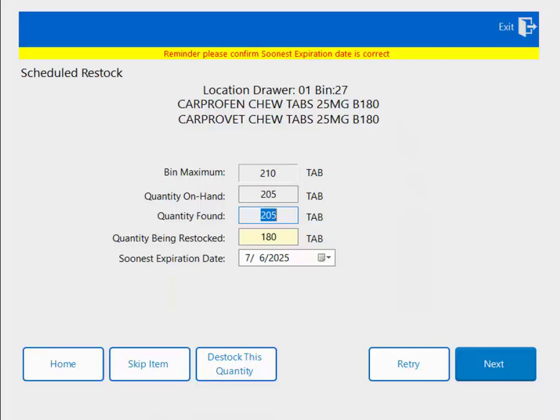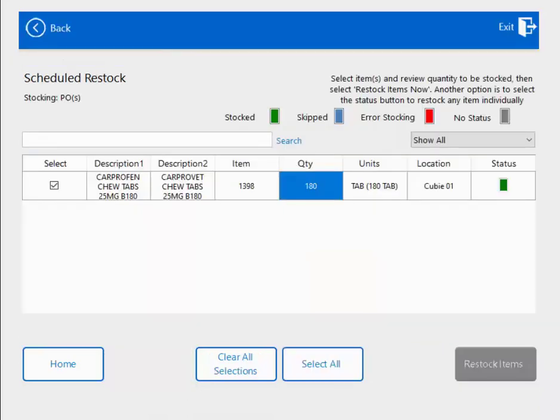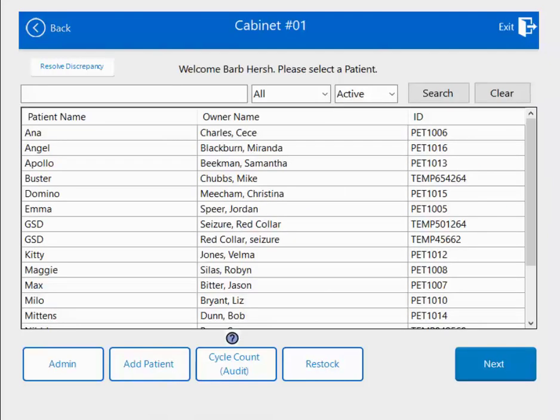I'm going to put the bottle into the Qubex, close the Qubex lid, close the drawer, and hit next. And once again I'm taken back to my restock confirmation screen, and the status is green showing that I did in fact restock this Carprofen.